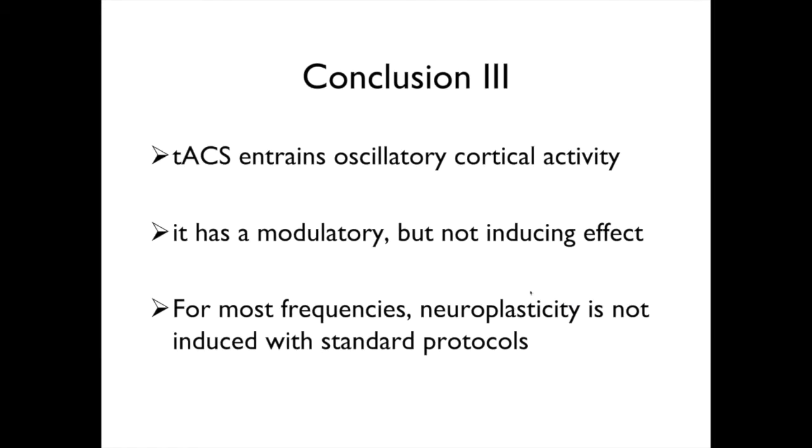So I could show you here that tACS entrains oscillatory cortical activity. It has a modulatory but not an inducing effect, which is important, I think. And for most frequencies, neuroplasticity is not induced with standard protocols, but with enhanced protocols. So with enhanced intensity and enhanced duration, at least with certain frequency bands, you get also neuroplastic effects.